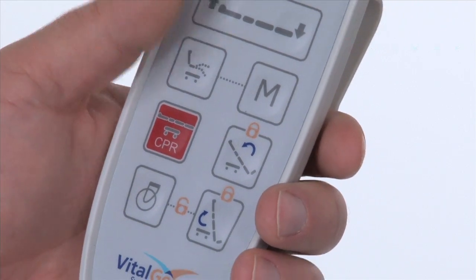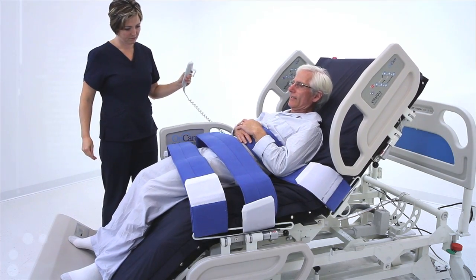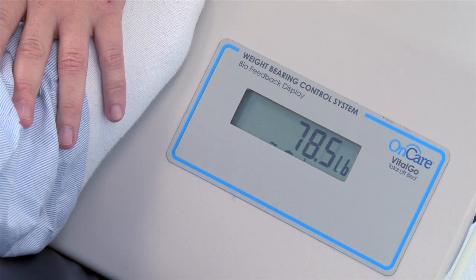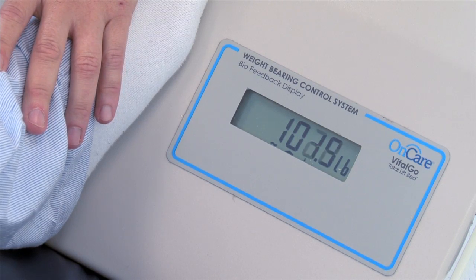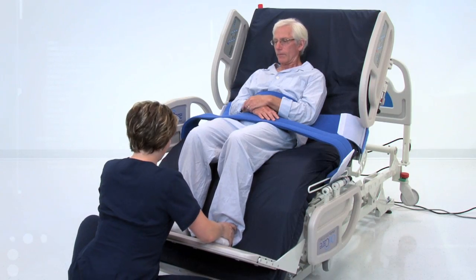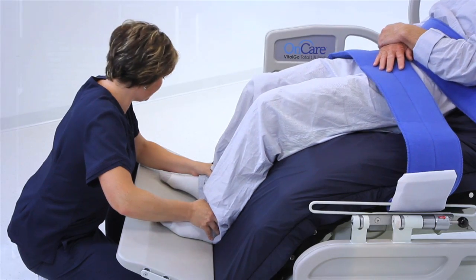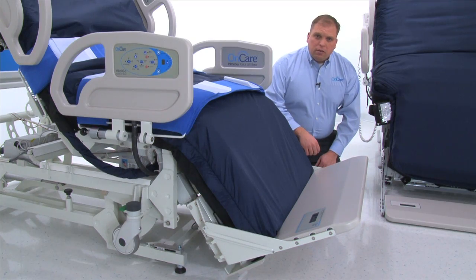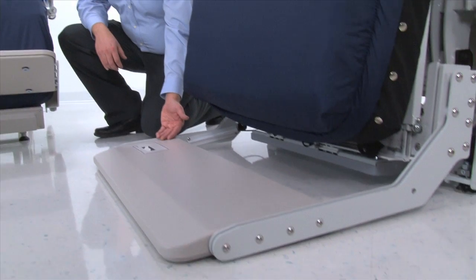Once a position is stored in memory, the bed will return to the memorized setting when the chair button is pressed. The integrated footboard scale provides biofeedback, giving therapists and patients an opportunity to set and reach therapy goals. Jerry, I want you to press down through your heels — try and get this number up to 100. The standard model positions the patient's feet at an angle off the floor, while the bariatric model can position the patient's feet level to the floor.